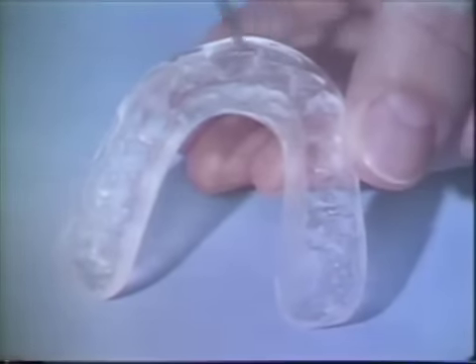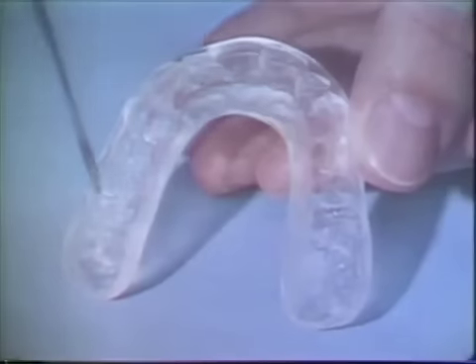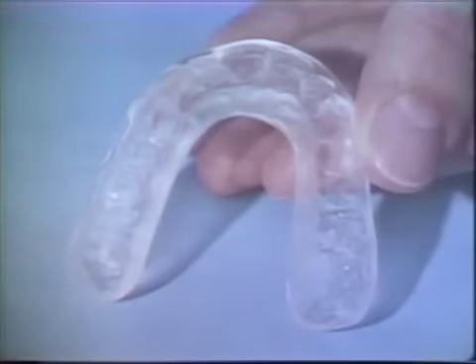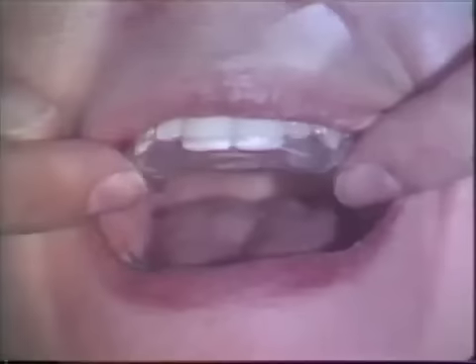Special attention should be paid to all occlusal surfaces. The bite plane is placed in the mouth and tested. It should seat perfectly without any rock. Self-curing acrylic should not be used in attempting to eliminate rocking, as adding acrylic to the tooth surfaces may cause movement of teeth.